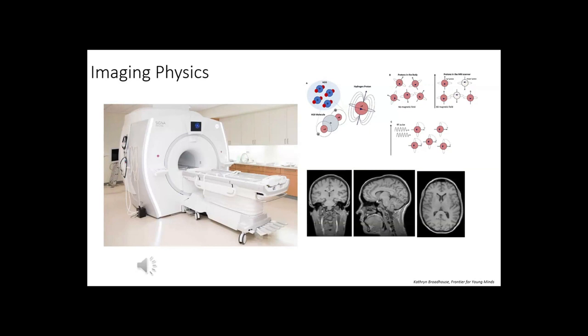It depends on the density of the molecules in the brain. This is our scalp, where there is a very small amount of water molecules. This dark fluid we call cerebral spinal fluid, CSF for short.